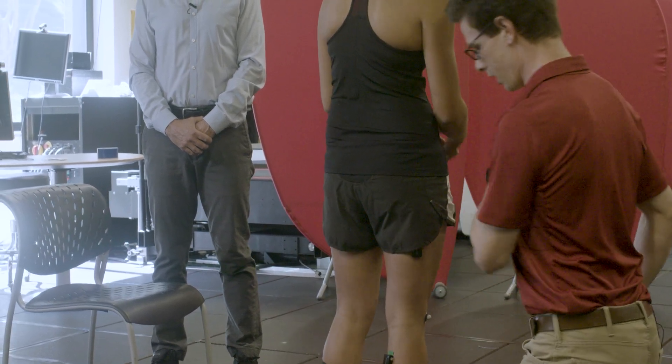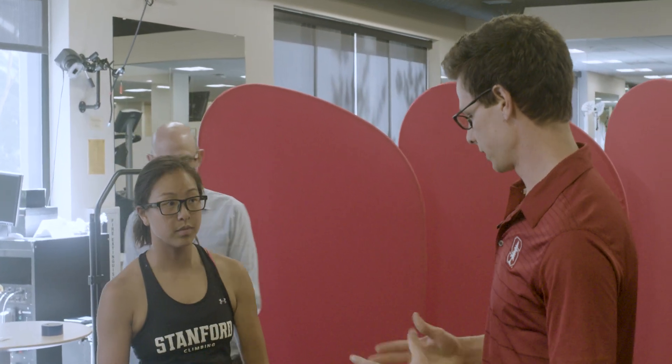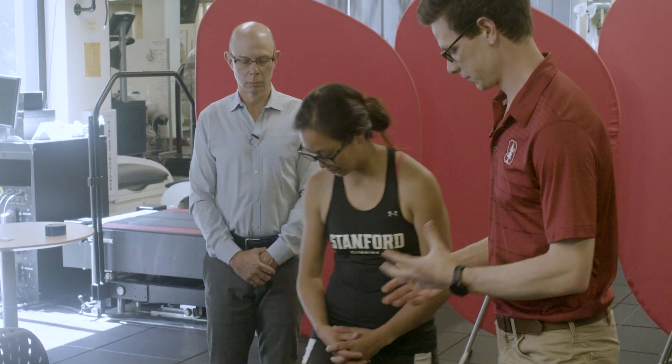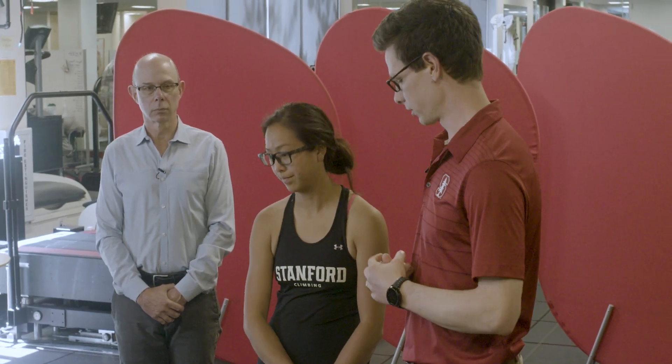Once we're comfortable with all of our electrode placements and have tested them, we want to make sure to wrap these electrodes with some sort of tape so they don't fall off during movements. Because if the sensor comes in and out of contact with the skin, we'll get poor measurements of voltage.